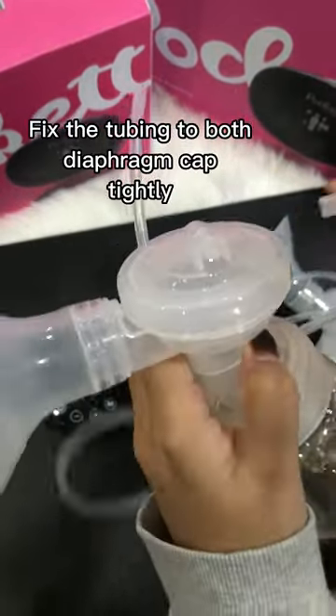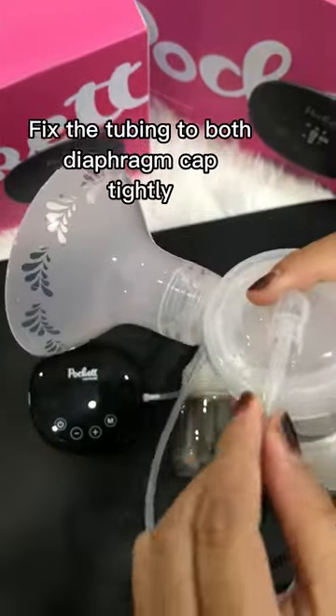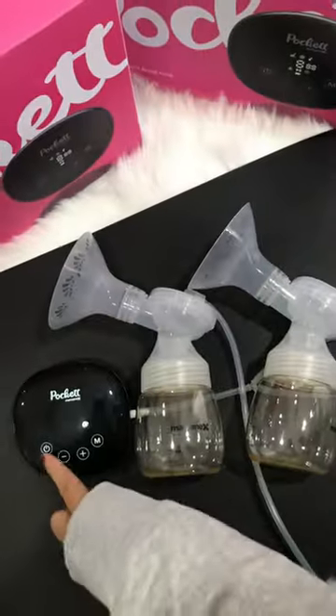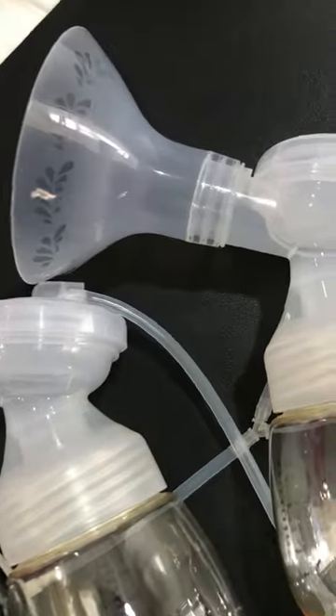Fix the tubing to both diaphragm caps tightly to complete the assembly.